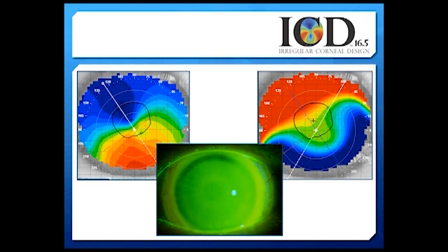And the question would be, are we clearing the peripheral cornea and limbus in our peripheral or our limbal clearance zone? Do we need to adjust this zone? And an excellent way to determine if you have inadequate clearance in the limbal clearance zone is to have the patient look in the opposite direction of the bearing. In this case, the patient is showing you arcuate bearing of the lens, or maybe not bearing, it could be thinning of the fluorescein pattern, where we actually are still vaulting, but the fluorescein and fluid is thin enough that it appears like bearing. So should we be concerned?